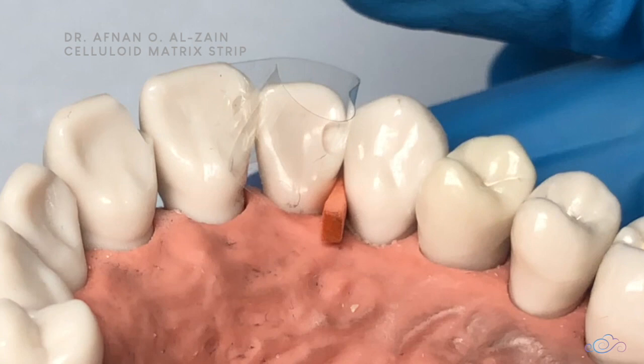How are you going to apply a celluloid matrix system and remove it? A celluloid matrix system is used in anterior restorations in Class 3 and Class 4.